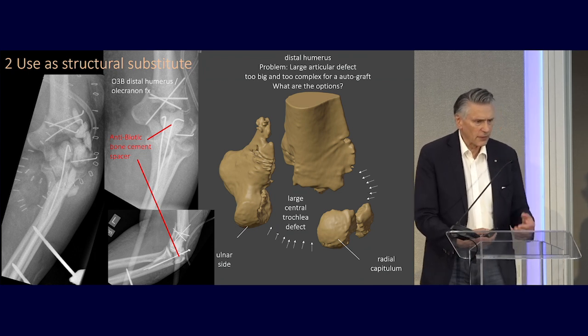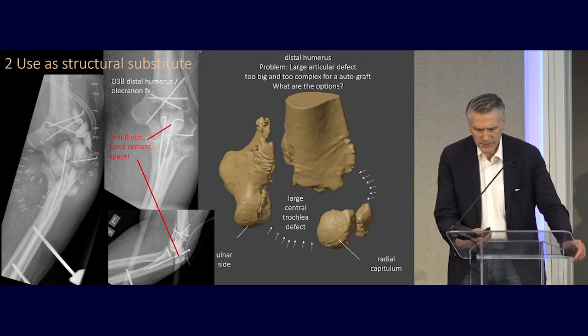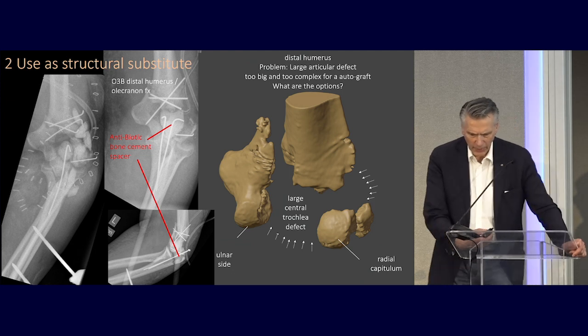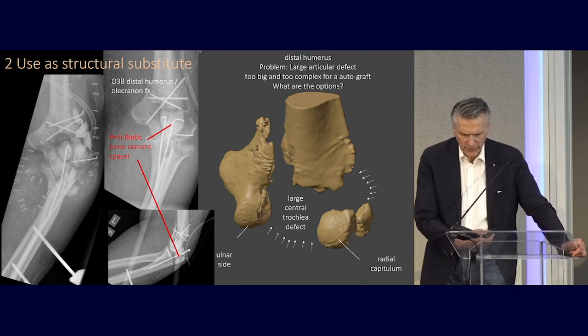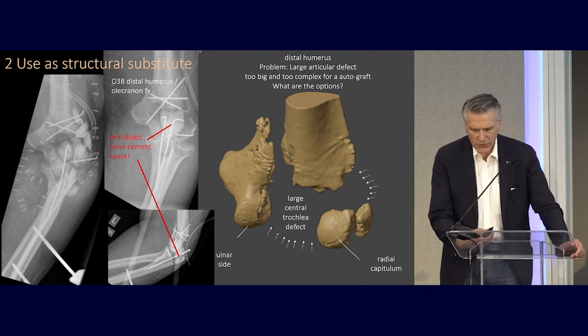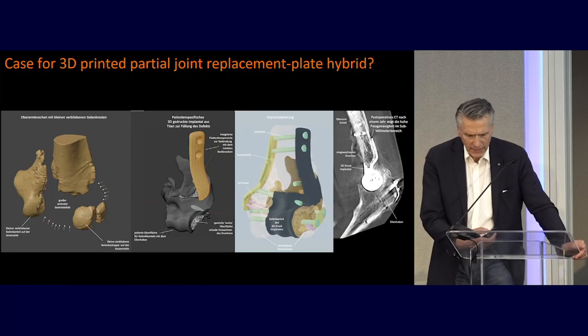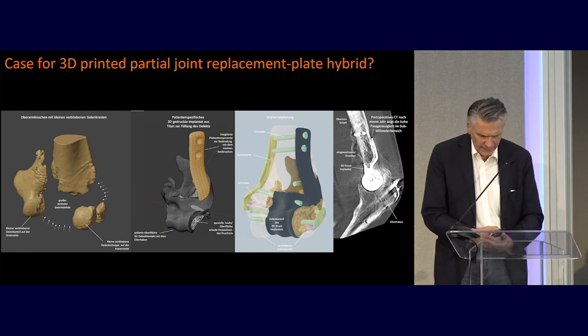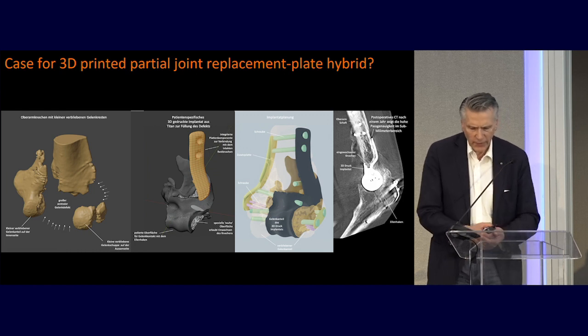So what are the therapeutic options in such a patient? They are quite limited. Elbow arthrodesis, elbow joint replacement, etc. But there are many parts of the joint which are still in good shape, so we were planning a customized segmental model for the defect.